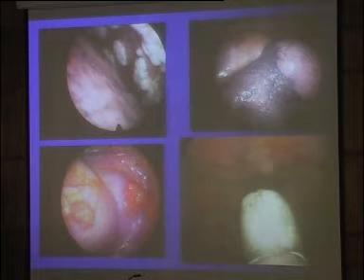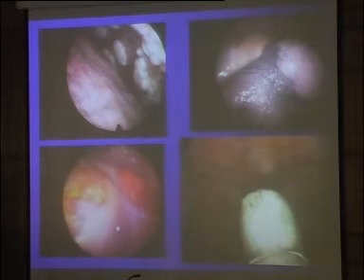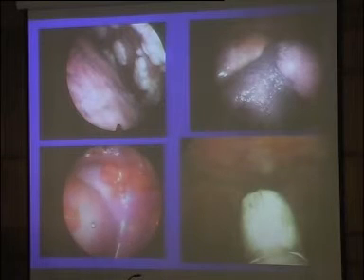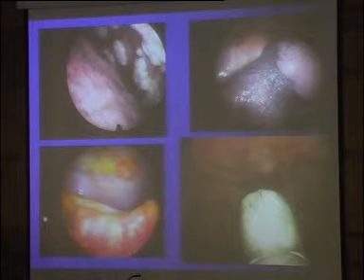You understand? Same for this patient. You see, it was a sarcoma actually, and you see the nodules are located on the diaphragm mainly. And then you cannot reach this. The other part and the gutter, you see, and the other part of the parietal pleura, etc., is free of disease. It's impossible to perform.